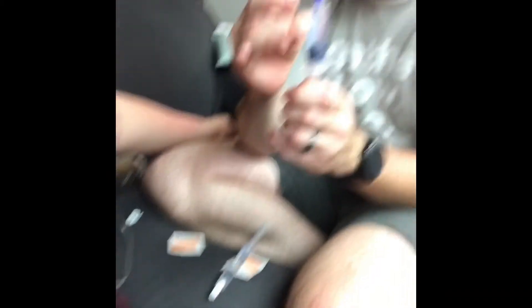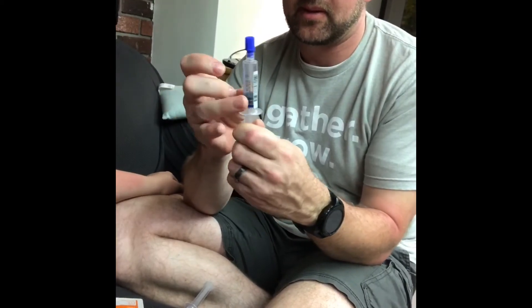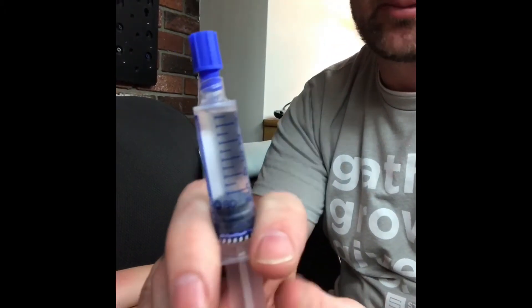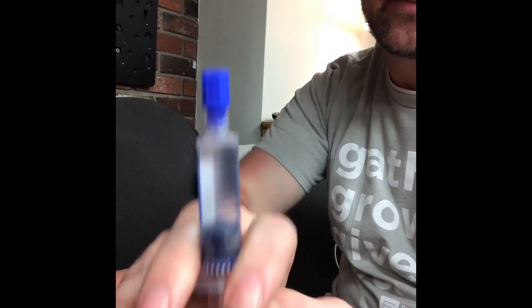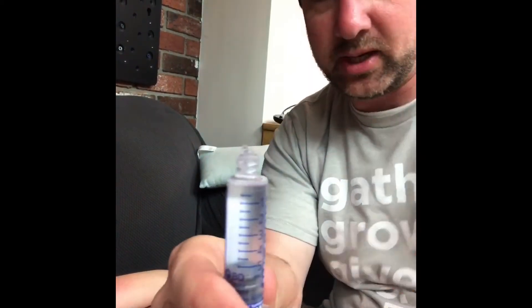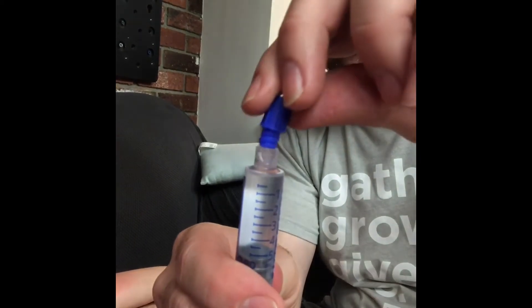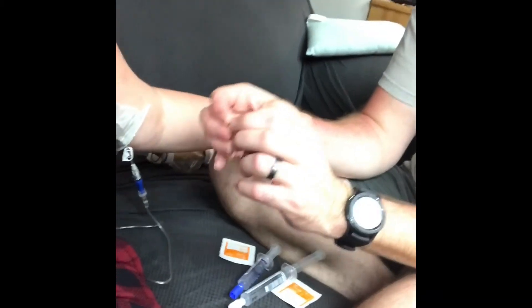And then the heparin — same thing. Make sure the air is up at the top, squeeze it, push it with the cap on to break the seal so it's easier to push out without spraying everywhere, then push the air out. The last part is this green little cap, which is a cover for when I disconnect.